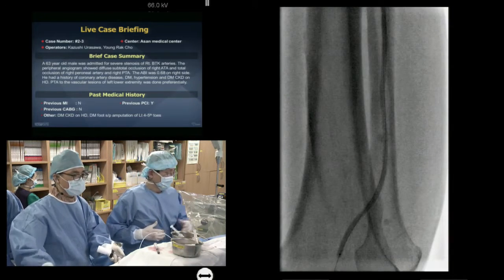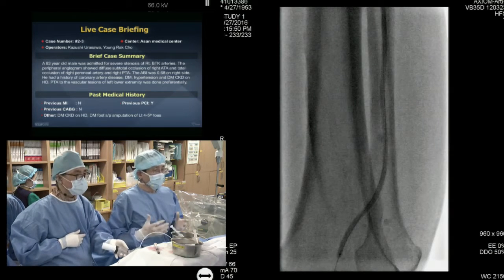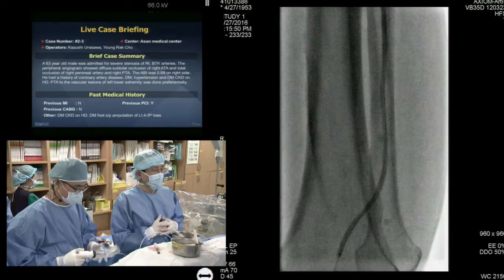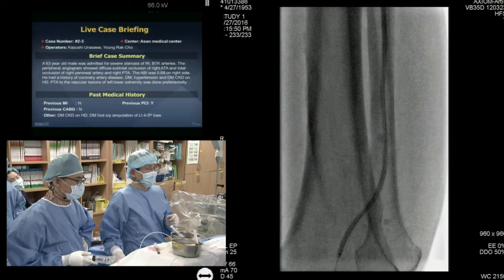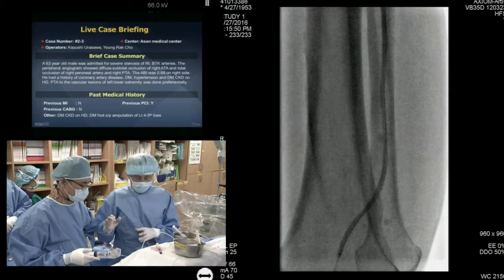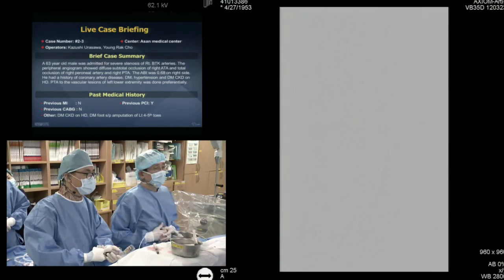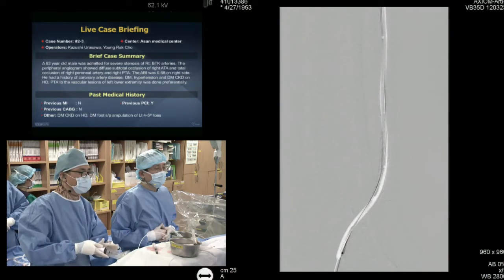You know, in the case of calcified lesions, it's sometimes quite difficult to see the full expansion of the balloon because of the calcium, or interference of the calcium shadow and the balloon contrast medium. In such case, it's quite useful to use the DSA mode to see the full expansion of the balloon. And let me show you the secret. Okay. I said, go. You should deflate the balloon quickly, okay? Go. So it's fully expanded.